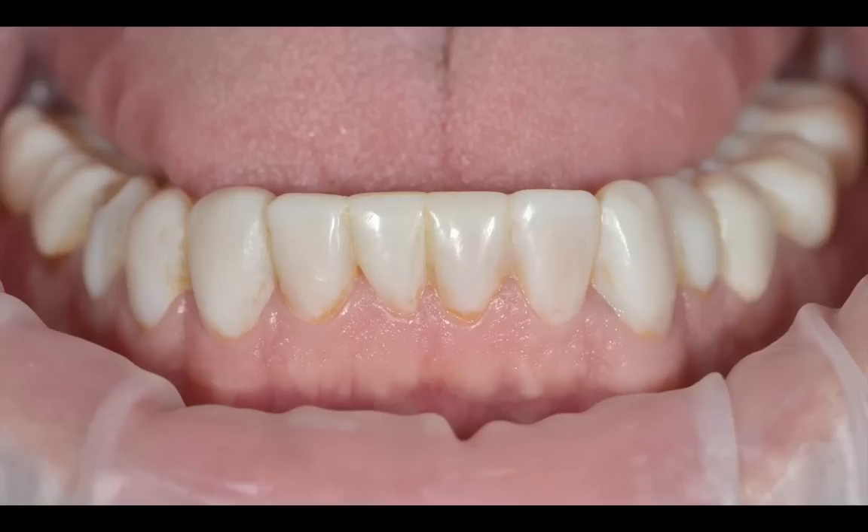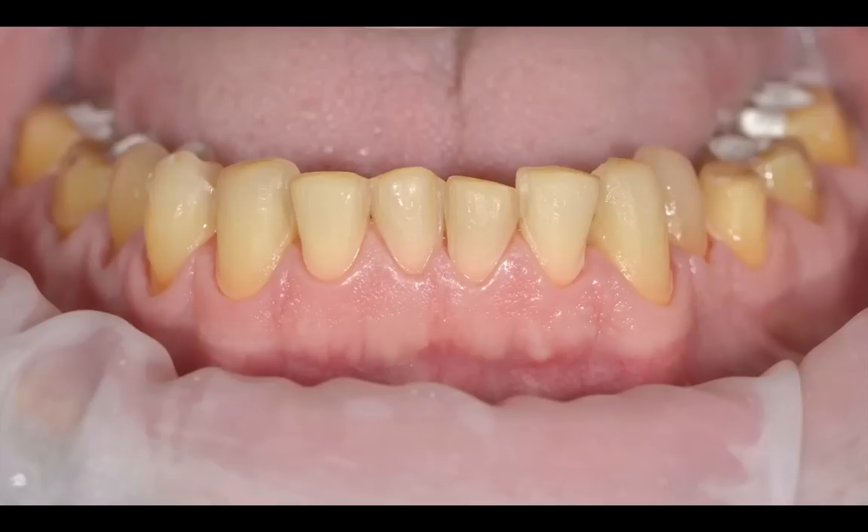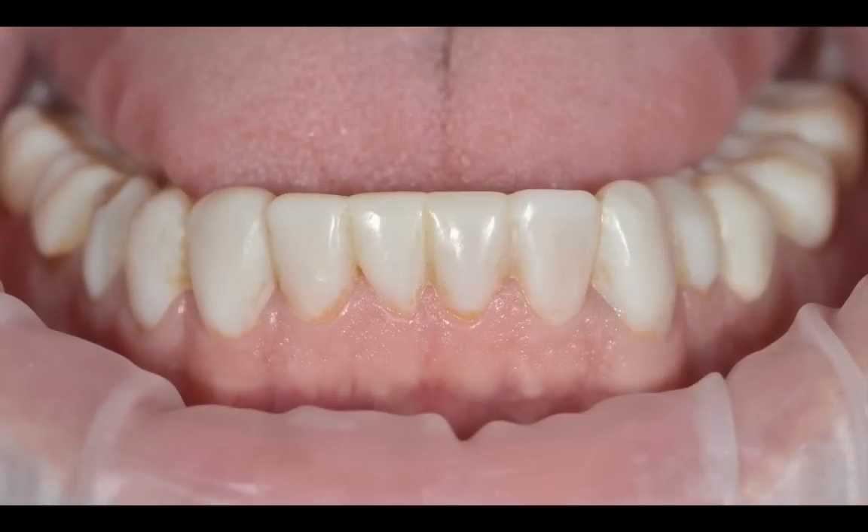The tissue was very healthy when I removed the provisionals. The prep photo was actually taken the date of seating when I removed the provisionals. You can see the tissue looks pretty darn healthy for having provisional restorations in his mouth for three months. And he wasn't able to floss — you could floss with floss threaders, but I'll tell you that he didn't. So again, provisional restorations.